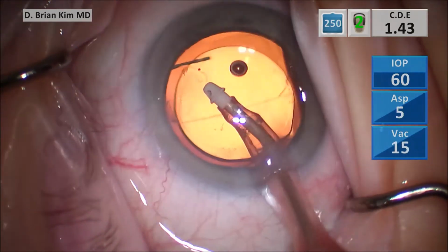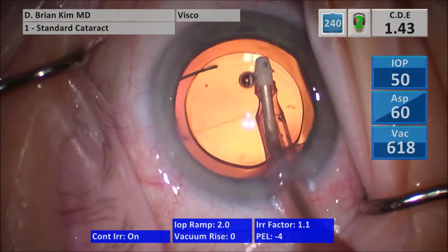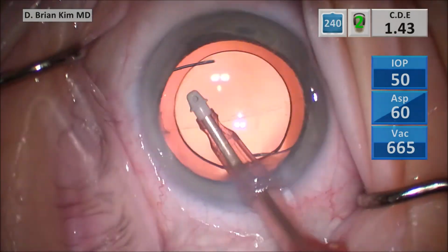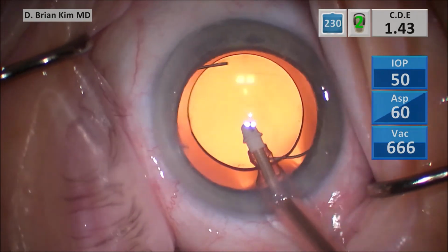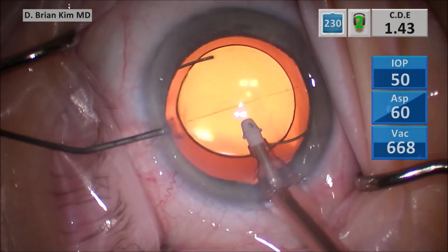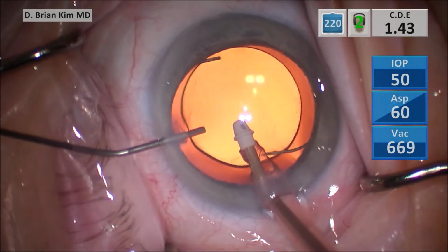So again, this patient had quite a bit of zonular laxity. These eyes tend to have a little bit of reverse pupillary block as well. You can see how much the pupil is moving here. That's because of the chamber being unstable after I widened the incision. So again, this patient has a little bit of a flaccid pupil as well as floppy, elastic zonules. You could tell during the spinning of the lens it was a little bit more difficult.